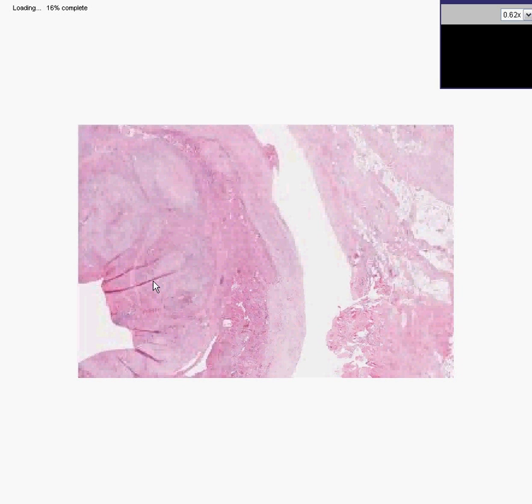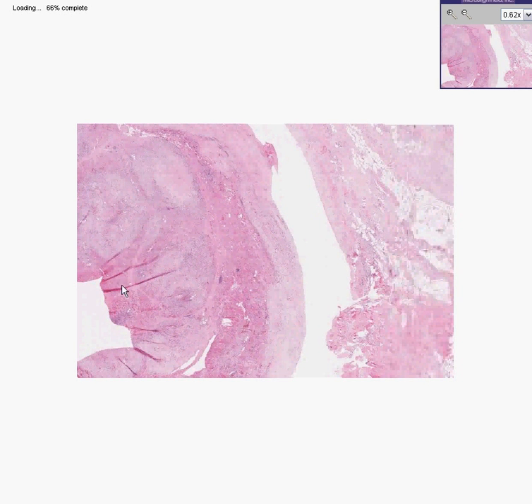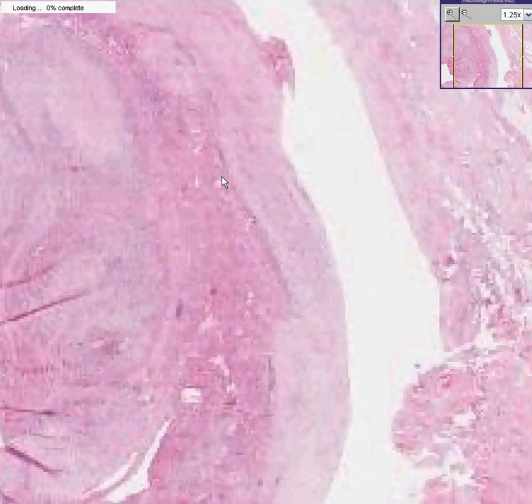And here is the mucosa, perhaps, or what's left of the mucosa. I really don't see much there. This looks like an extensively infiltrated submucosa. This looks like there's a lot of disrupted smooth muscle fibers of the wall, and this is a diffusely fibrotic serosa. This is the world's best, most classic microscopic picture of a linitis plastica.